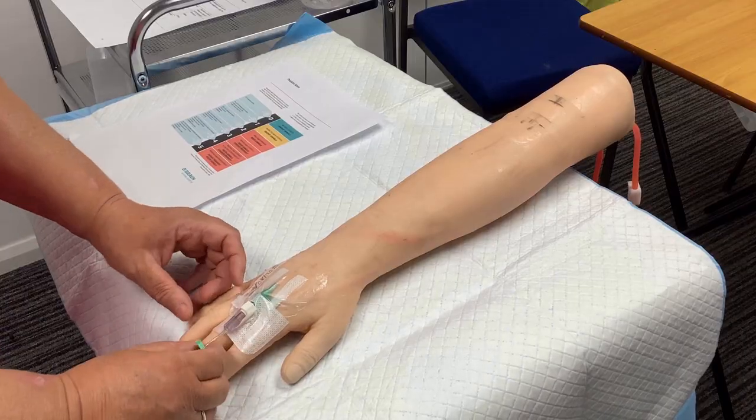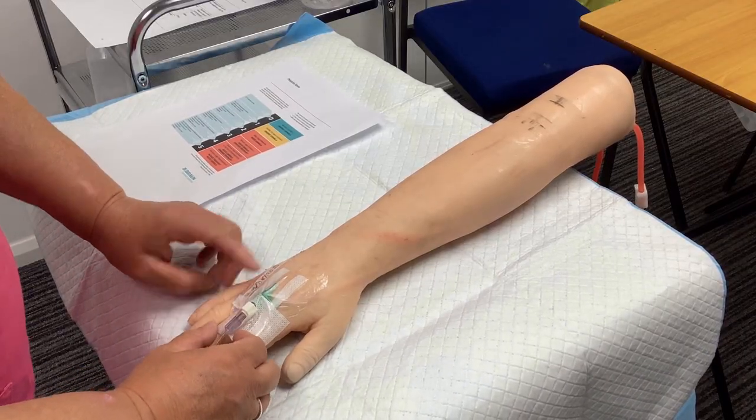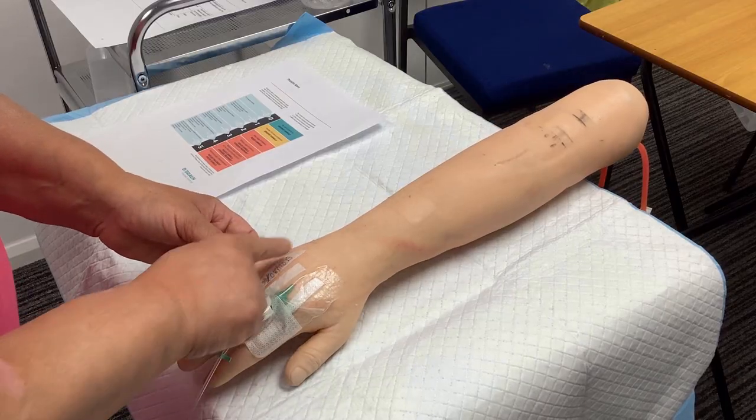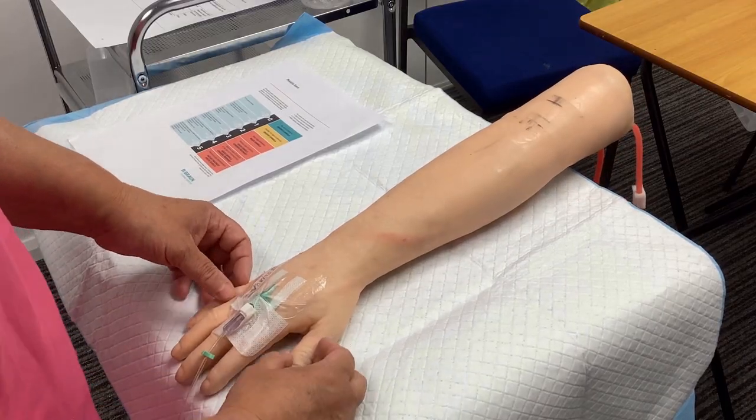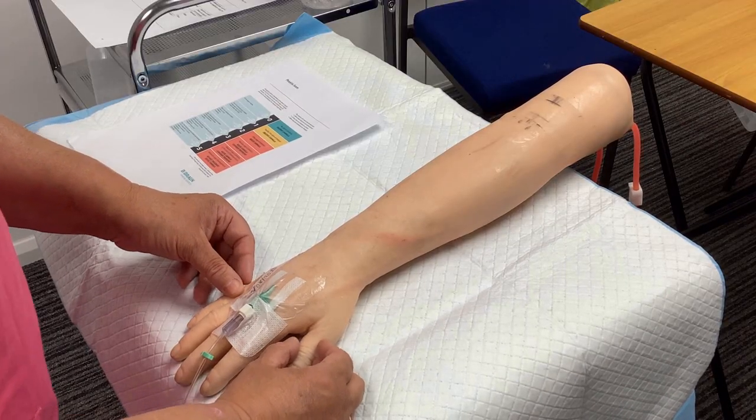Looking at the needle in the end. First of all, I'm noticing it's got the date put on there of when this cannula was put in, and that's within 72 hours, so we know we can use that.